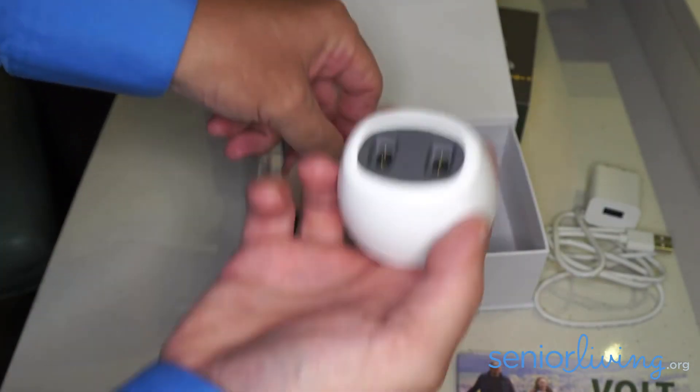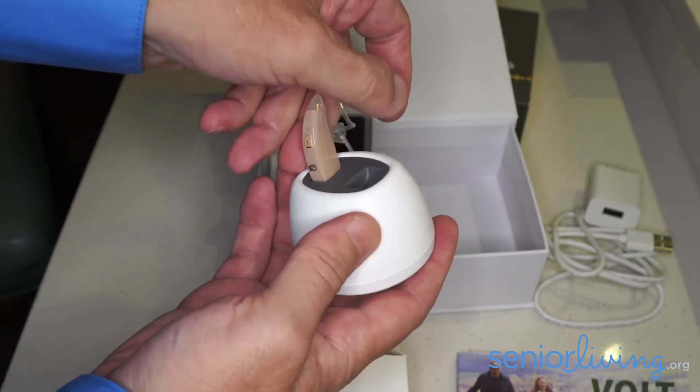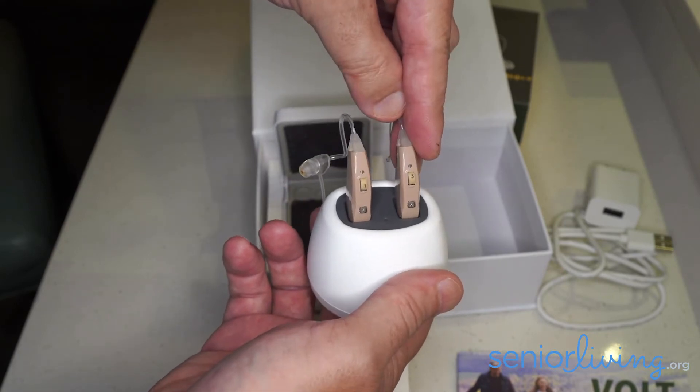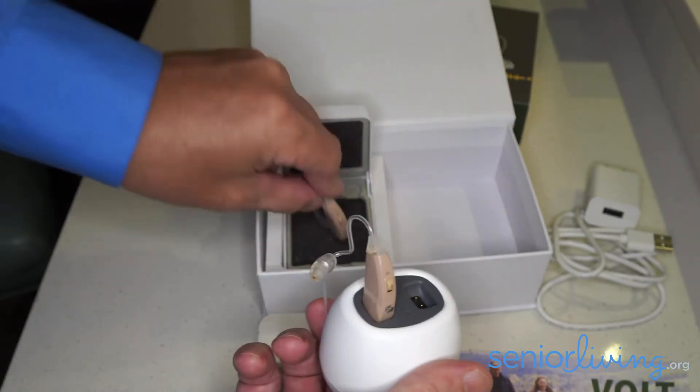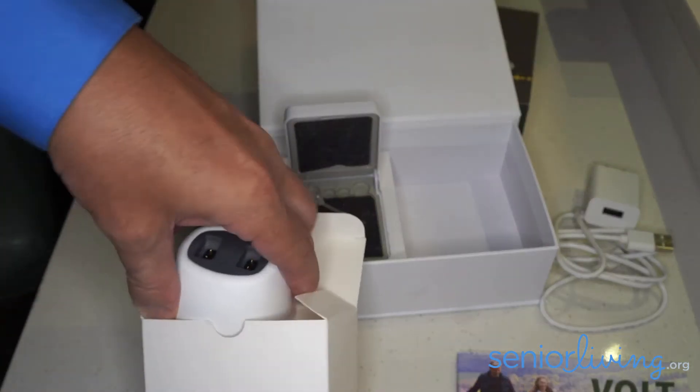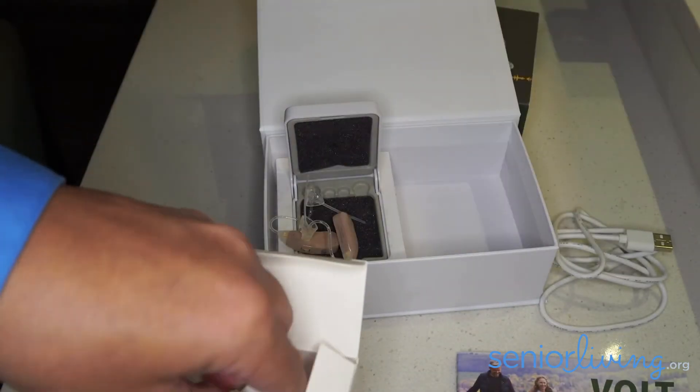So every night what you'll do is you'll have this plugged in and you'll just plug your hearing aids in here, and that will charge up your hearing aids every night. We have a review on these hearing aids on our website, SeniorLiving.org, and I encourage you to check it out.